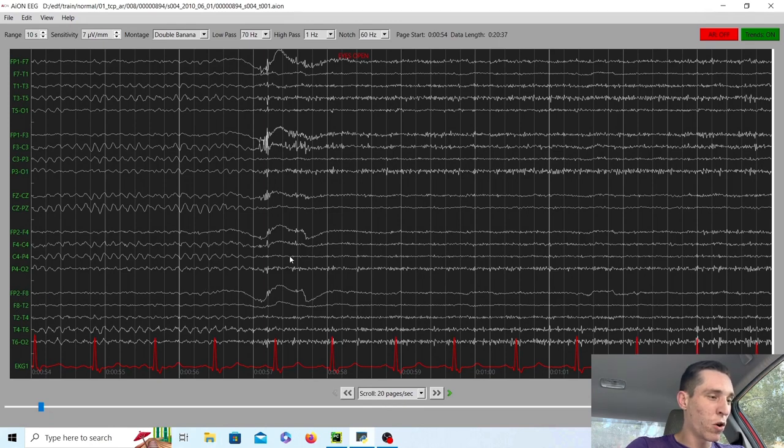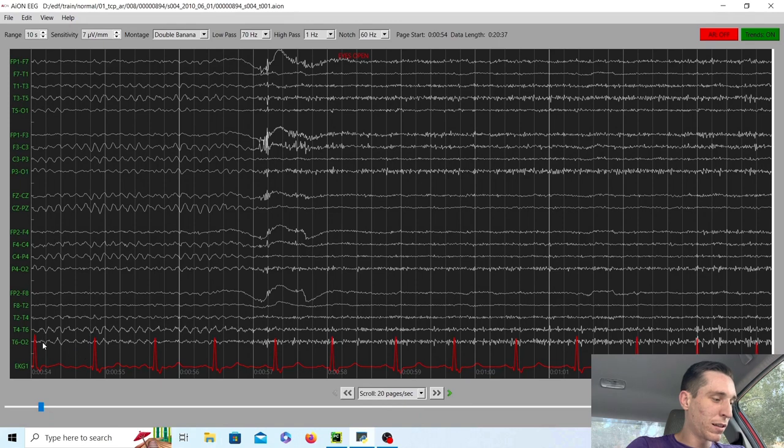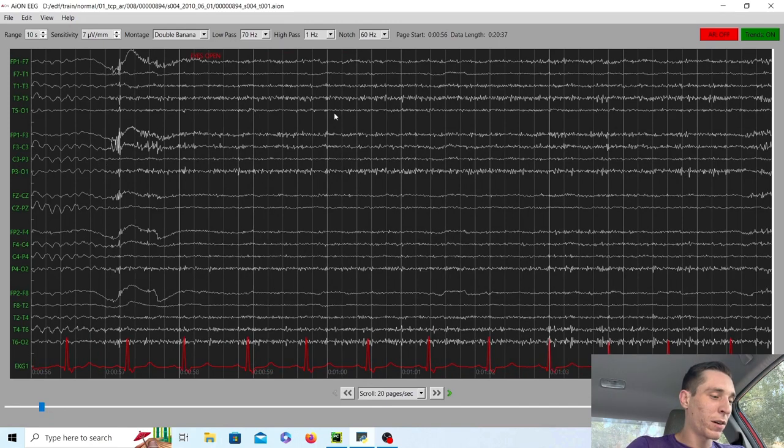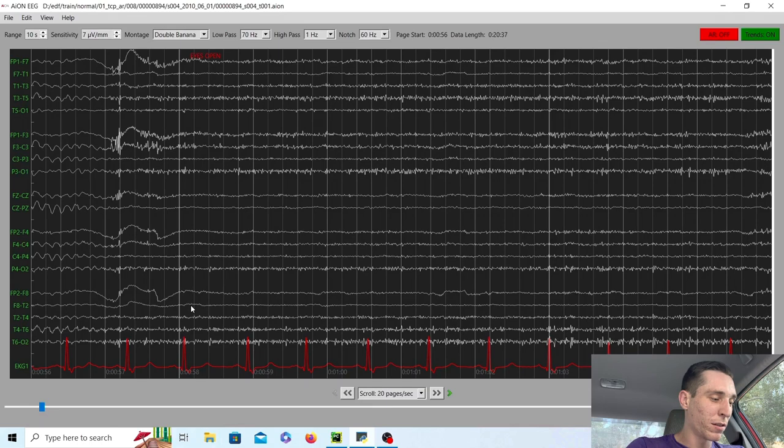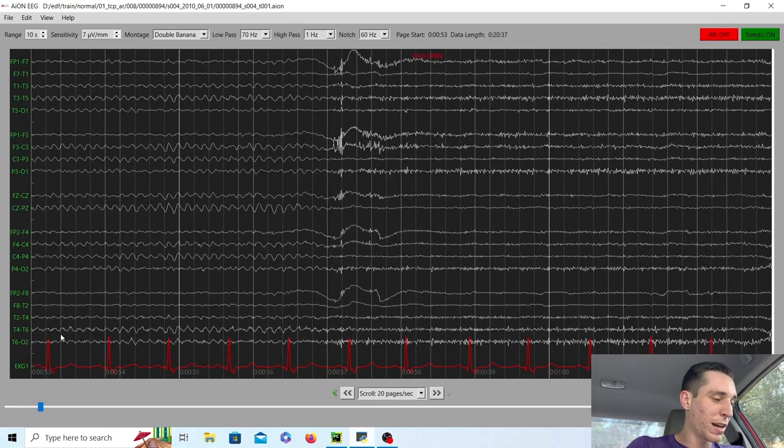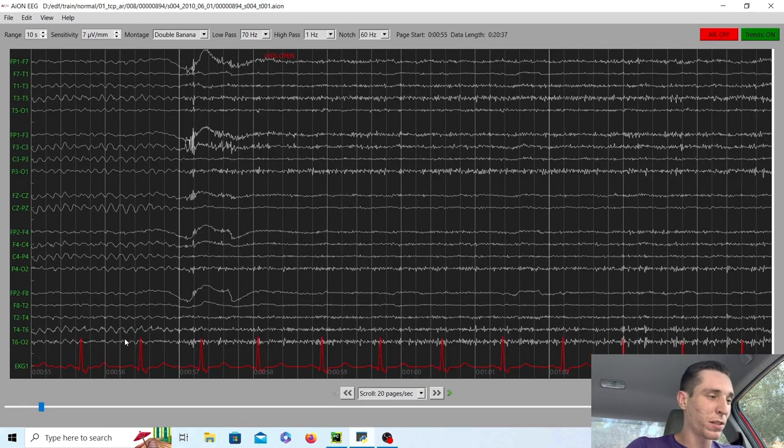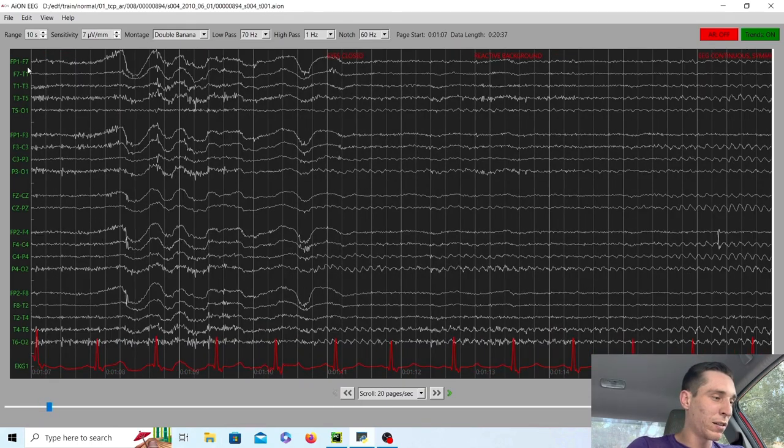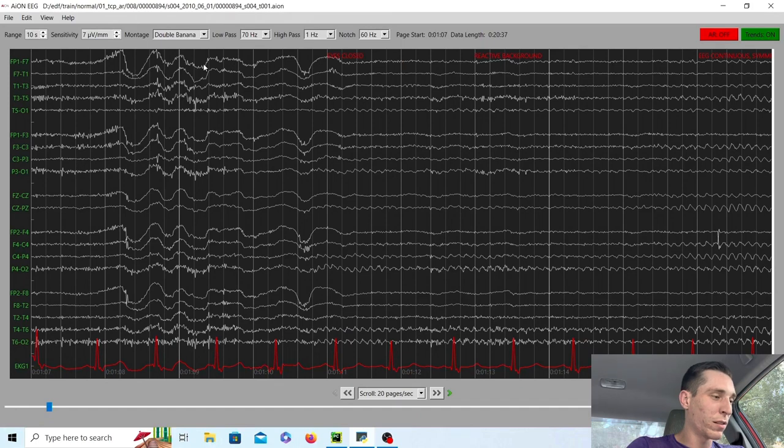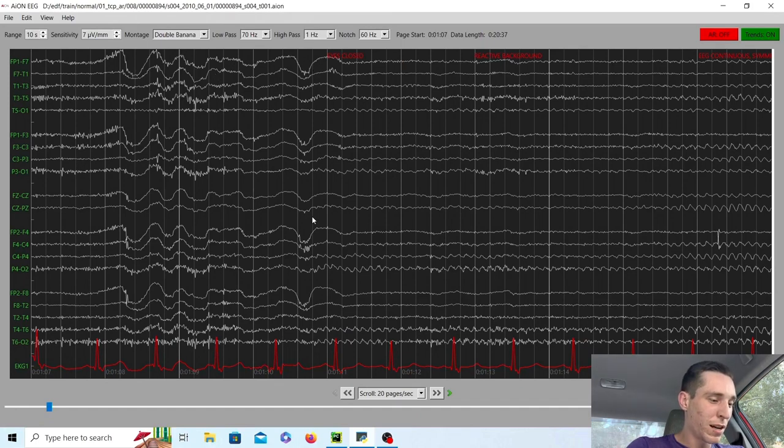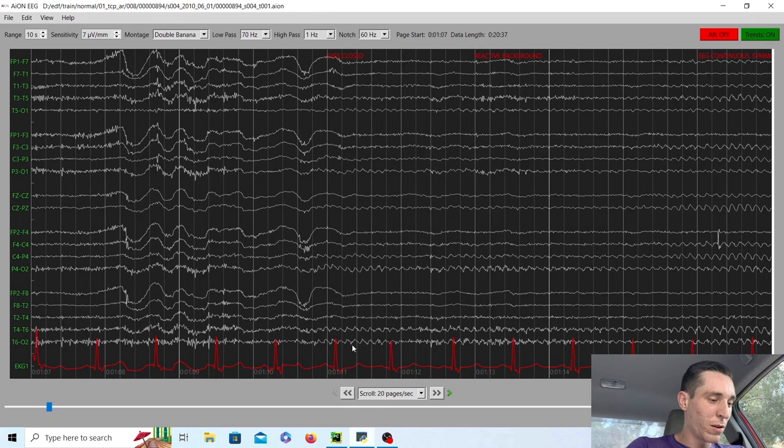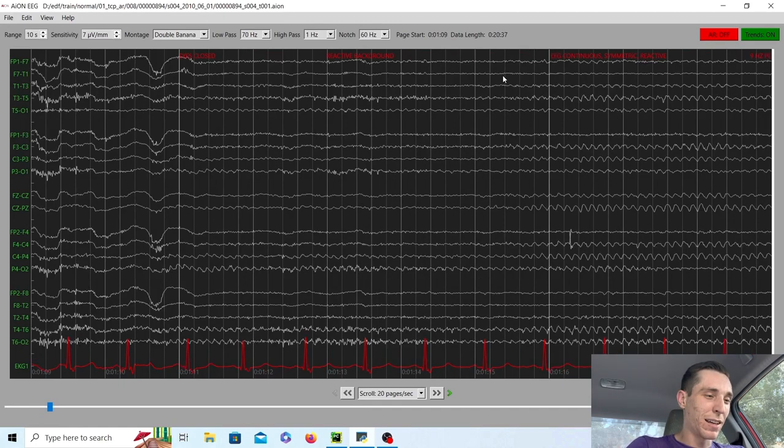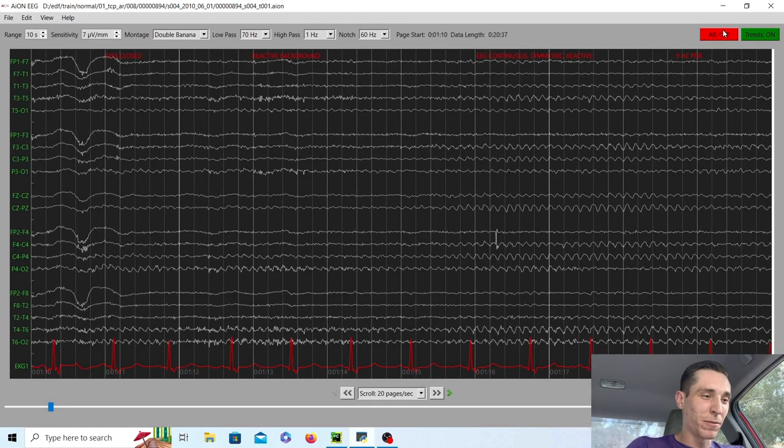The eyes open and it looks like back here when they were closed it's probably about nine waves per second and when they open the background attenuates. It essentially goes away. You no longer see that nine waves per second and when they go back and do some weird stuff with their eyes here and then essentially close their eyes right here, the nine waves per second background reappears. So that is what you would call a reactive background. That is a good thing.